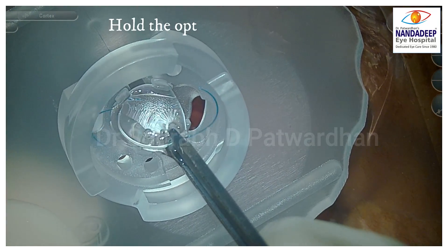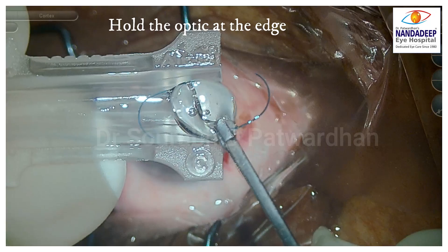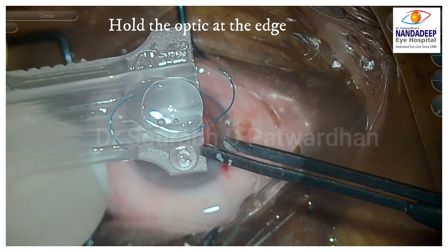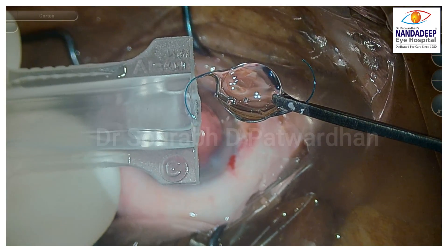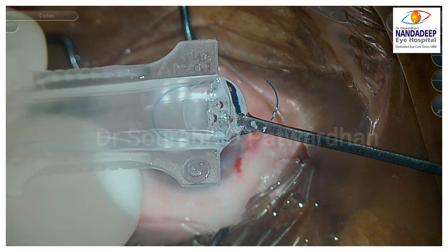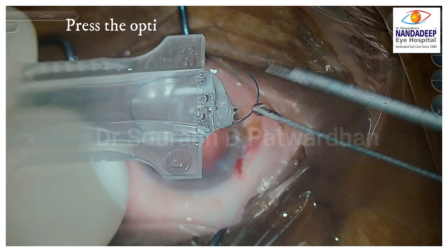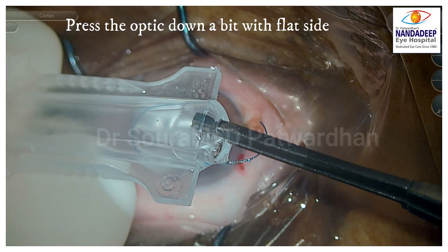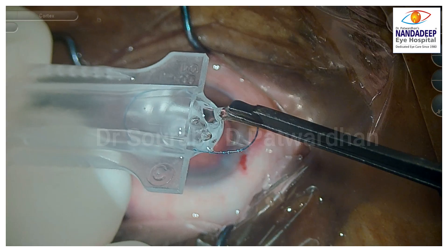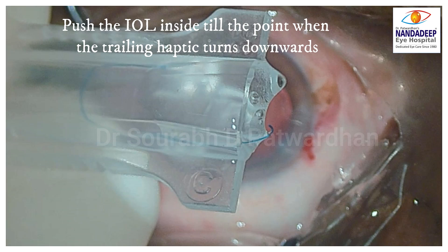This is the three-piece Alcon IOL. I am going to hold the optic at the edge — never hold at the center — and I am going to use the C cartridge. You can see it goes through a 2.8mm incision. Hold the optic at the edge again and carefully place it inside the cartridge. Now watch as I push it in — use the flat part of the forceps to press the optic down just a bit, bending it slightly posteriorly. Don't press too hard. Then push the optic inside until the trailing haptic turns downward — that is the point to which you should push.